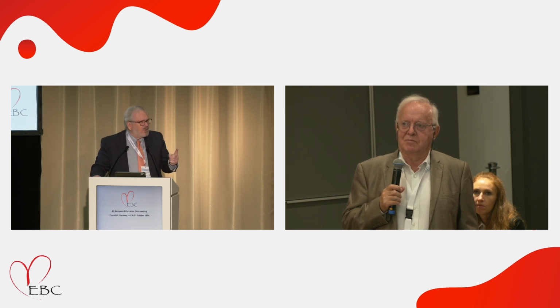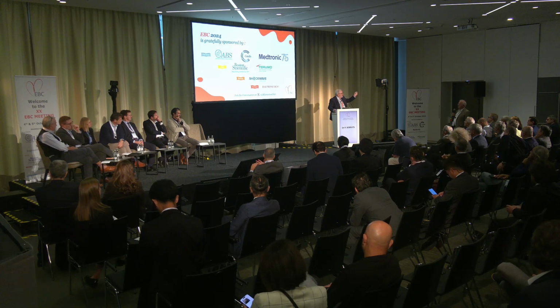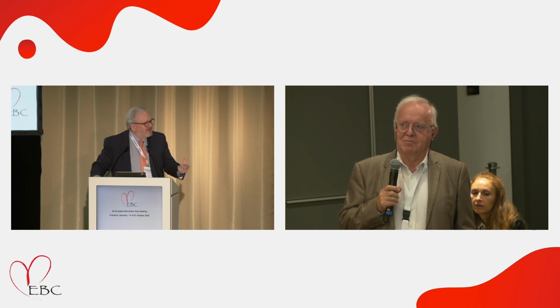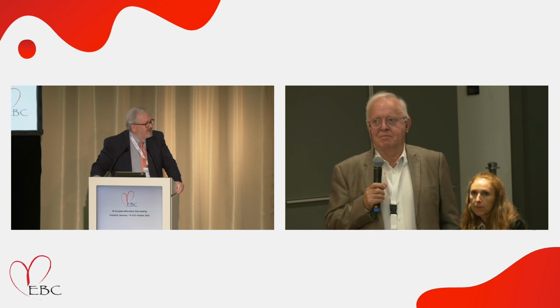That's point number one. Point number two, with the blooming effect disappearing, it's very easy to subtract the calcium. That's what the people do. But now you have a high resolution. So if you look at the finite element of the whole system and the finite element of the same vessel done now, you gain. So everything is going to be more precise. FFR-CT will be more precise. So I think that's the way to answer your question. So the 5%, I don't know exactly what it will be, but it will be better.